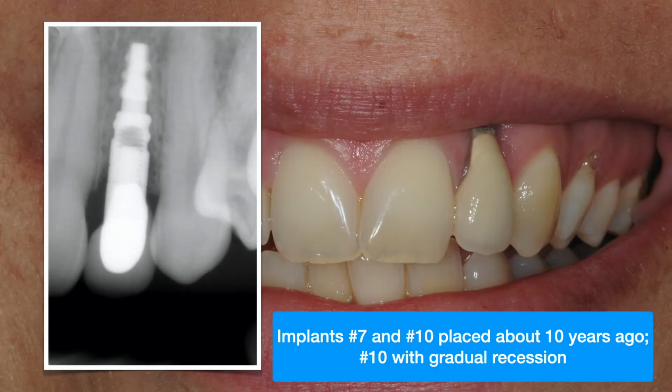The patient came to us with implants number 7 and 10 that were placed about 10 years ago. The number 10 site gradually developed some recession over the years. Her chief complaint was just poor aesthetics. She was very aware and conscious of the aesthetic issue with the recession. This is the x-ray that she had initially.